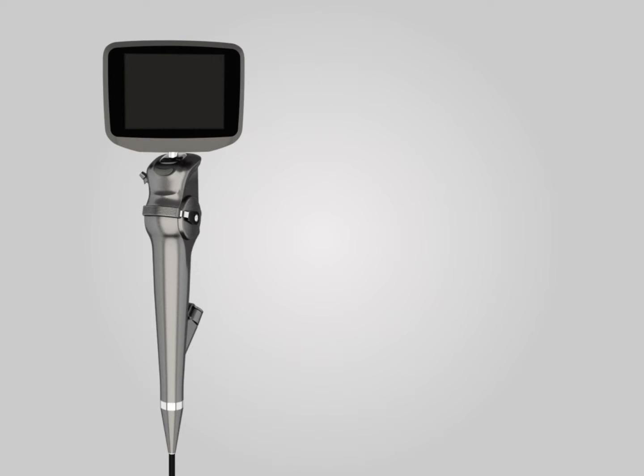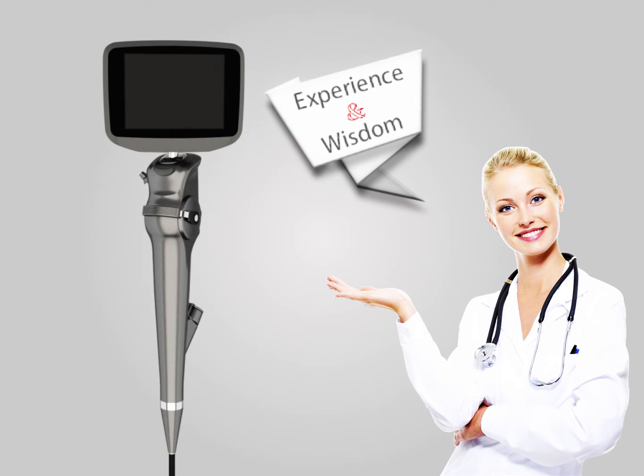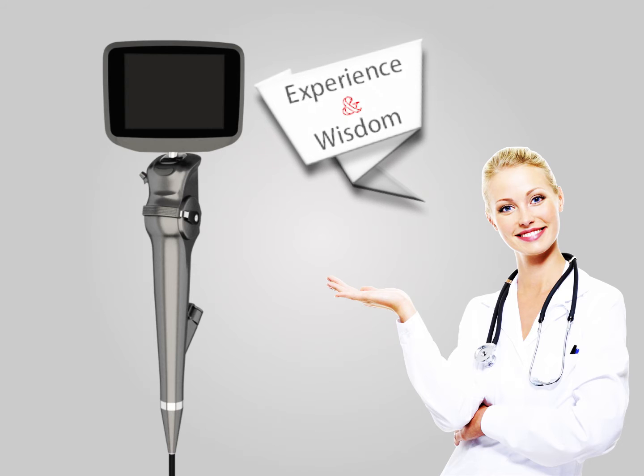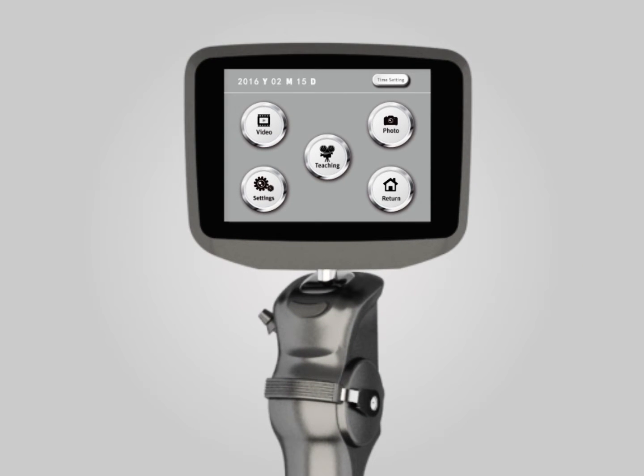The INSIGHT IS3 is a good assistance tool in airway management. We understand that the experience and wisdom of doctors are most valuable. Therefore, we designed powerful multimedia functions for the IS3, such as photography, video recording, and sound recording, so that doctors can continually record good clinical cases by video or picture and use them for academic sharing.